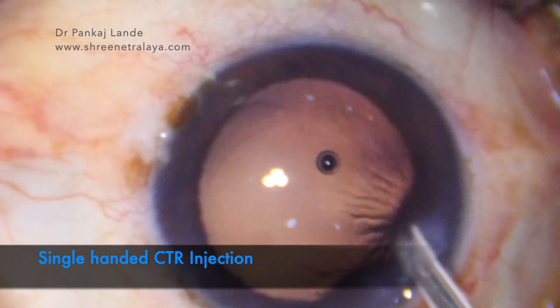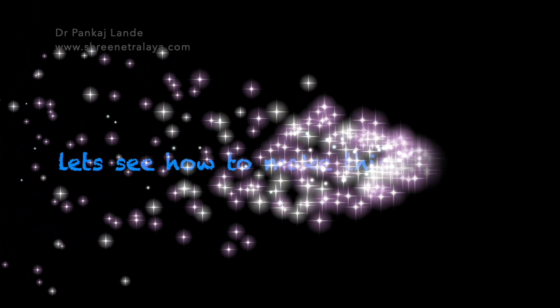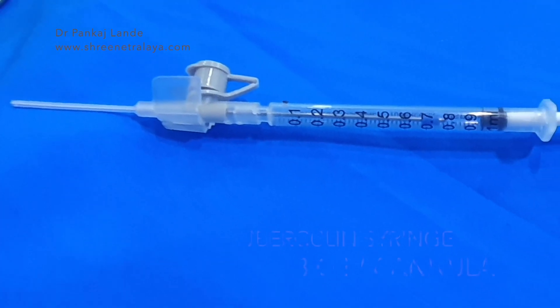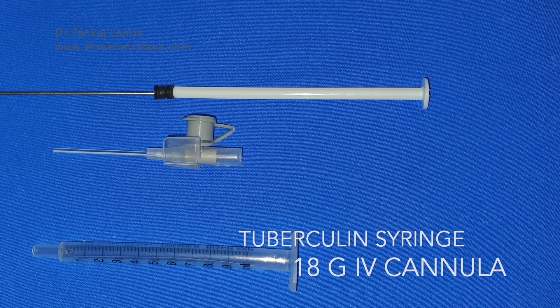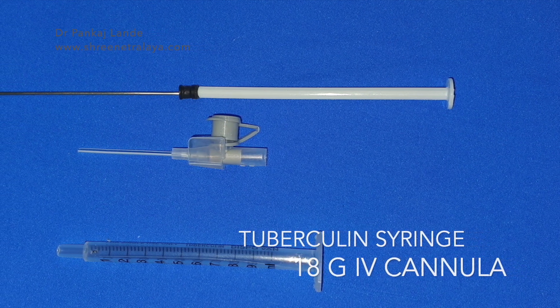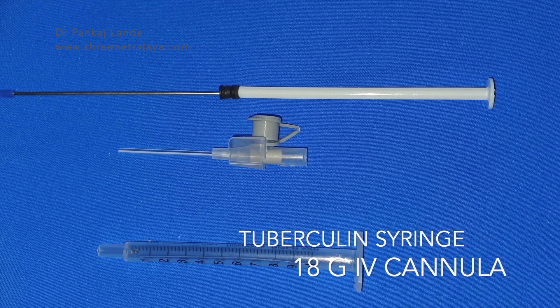It is also useful in toric IOL cases where it stabilizes the IOL and prevents rotation of the IOL. So let's see how to make this single-handed CTR injection system. The components are very simple: a 1ml tuberculin syringe and an 18 gauge IV cannula.